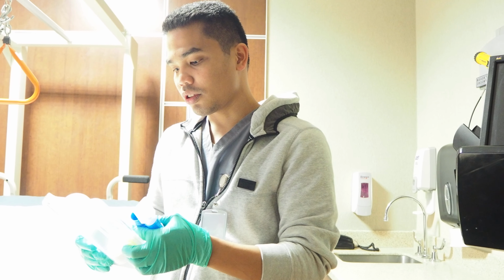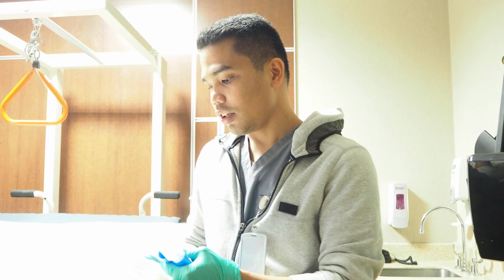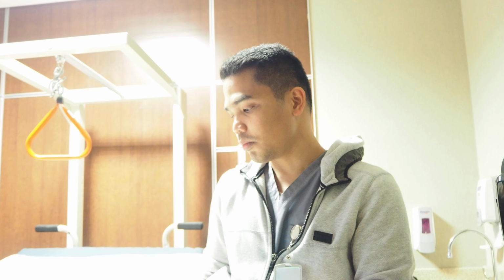We can also start with about 5 breaths per hour, until such time that they can tolerate it, and then we can do the ideal setting of 10 breaths per hour. When done, educate the patient to use this every hour, so that it would help them exercise their lungs even more.